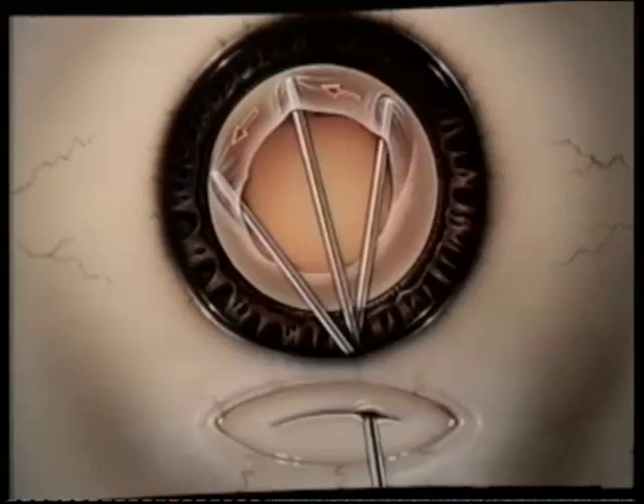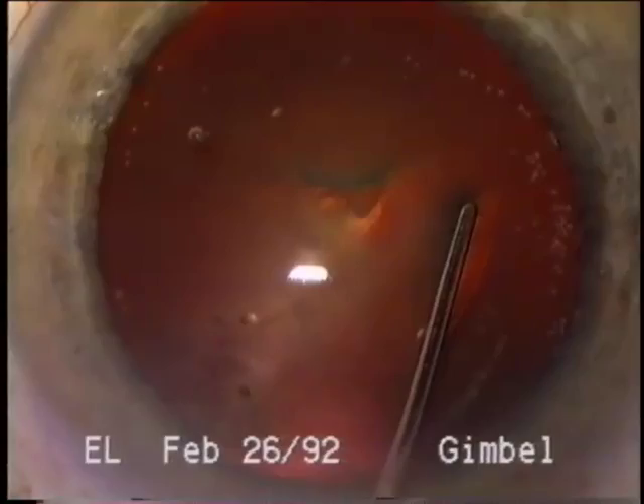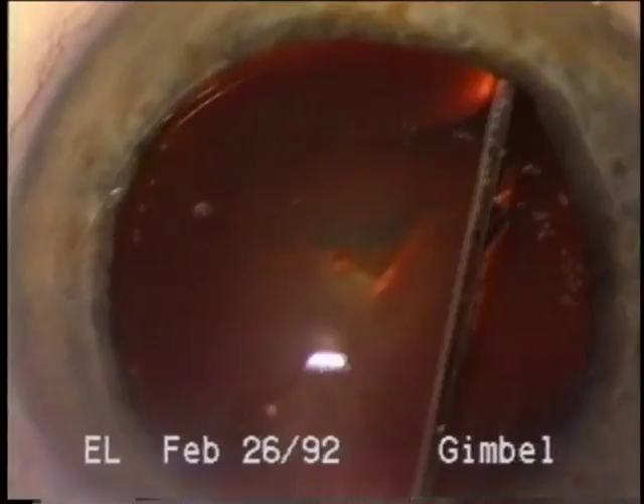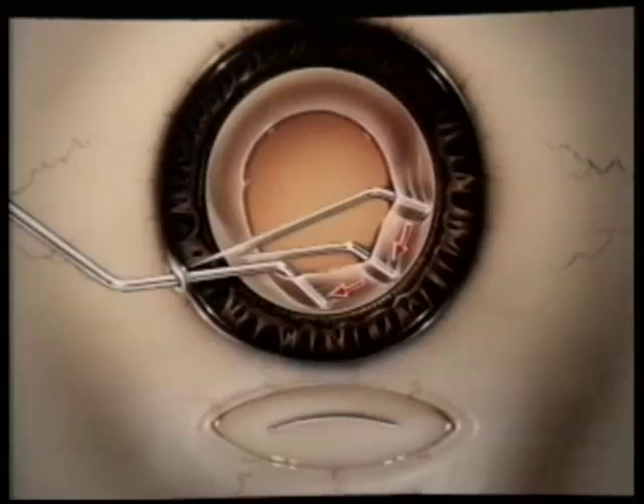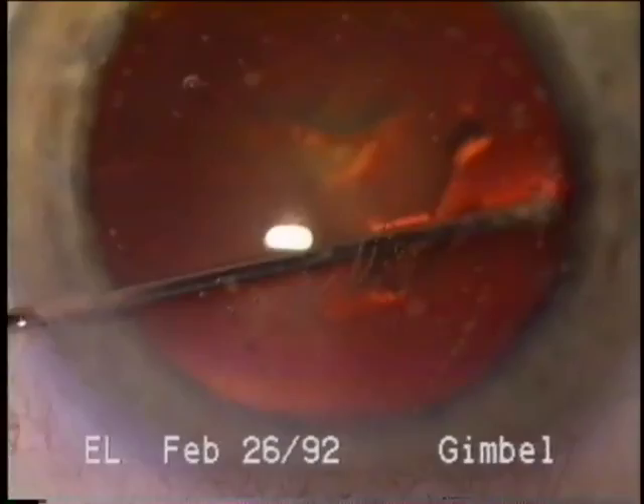The essence of the hydro-free dissection technique, then, is this manual lifting of the capsule, followed by a sweeping motion with the cannula to separate the capsule from the cortex — first inferiorly and as far as one can reach with the cannula, and then through the side port incision, either with a bent cannula or, as shown in the surgical footage, with a straight cannula for the upper portion. There may be a small area under the side port that cannot be reached.